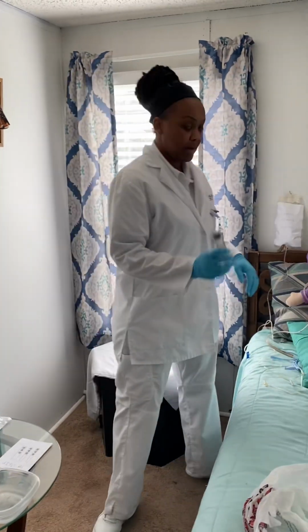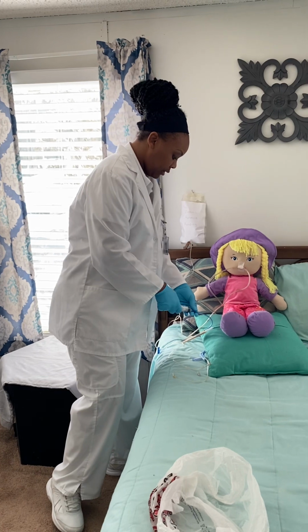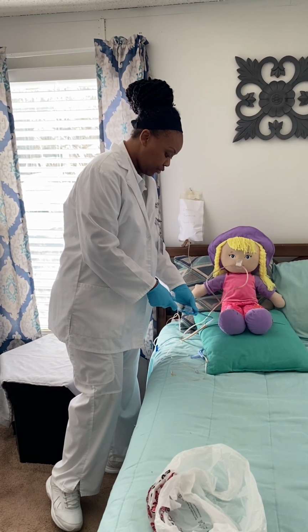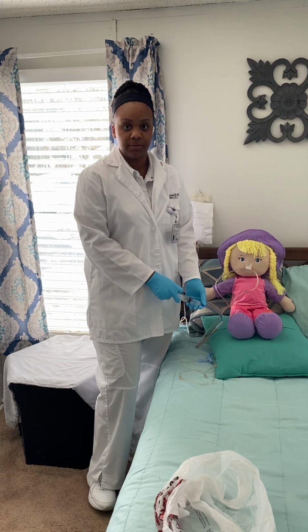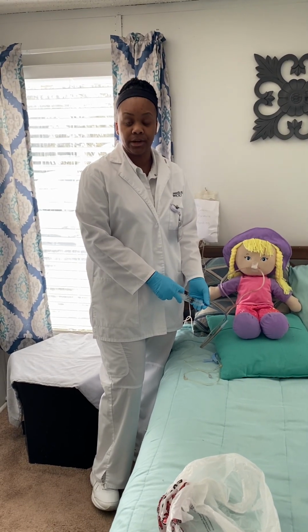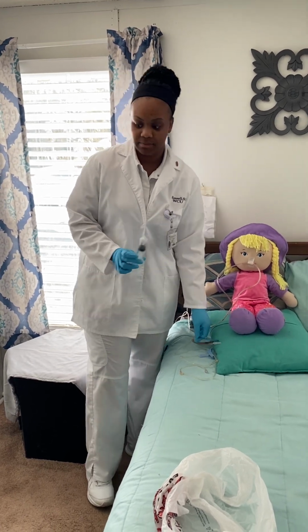After I've done that, I'm now going to check for gastric residual. So once I'm pulling back, I'll pull back until I no longer can get any more residual. And at this point, if you have less than 250 mils of residual, then you can go ahead and return the feedings. If you have greater than 500 mils or 2 checks of greater than 250 mils, then you would stop the feeding and you would not return the feeding back to the patient.